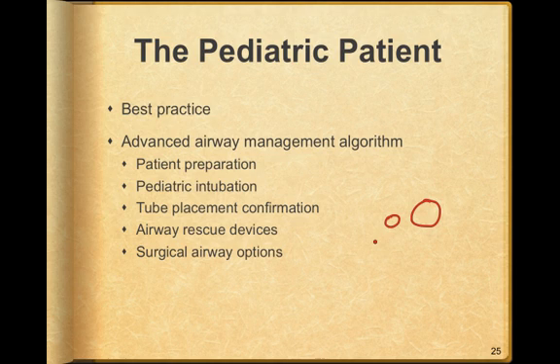Tube placement confirmation. Once we have the tube in the right location and the appropriate size tube, it would be my suggestion to you to use a colorimetric device, and to use the Broselow tape, weight-based tape essentially, so that we give the appropriate size ET tube. Now, since they are uncuffed, please pull out, whenever you're intubating, a tube size below and a tube size above. The tube itself should provide a friction fit into the cricoid ring. If it does not, then the airway is not the appropriate size.